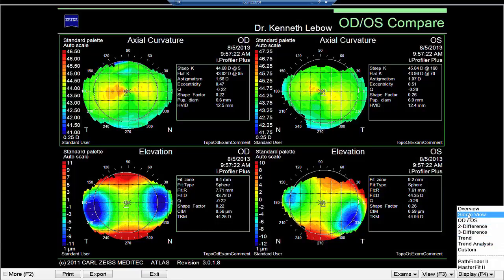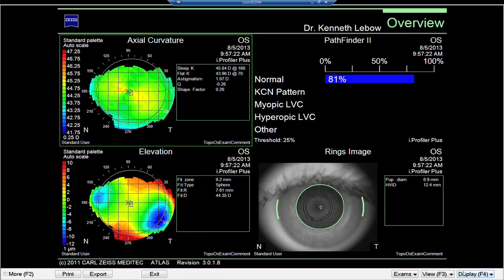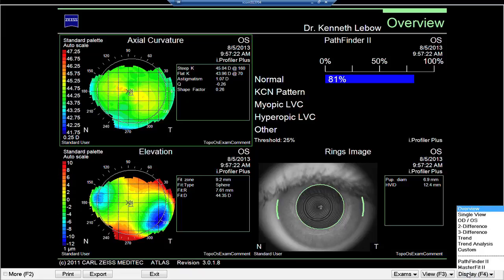The left eye shows about a diopter of astigmatism, and refractively Beth shows about a diopter and three-quarters of astigmatism. These are very normal maps. The overview map for the left eye also shows the oblique astigmatism — it shows that it's normal. Based on Pathfinder analysis, there's no unusual elevation and the ring images are perfectly normal.